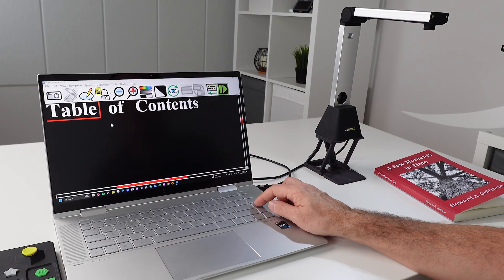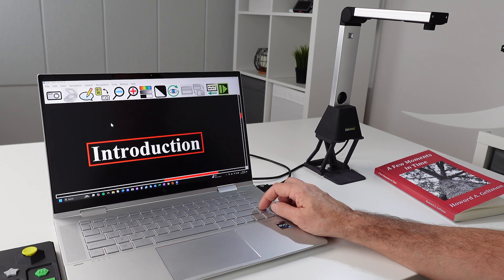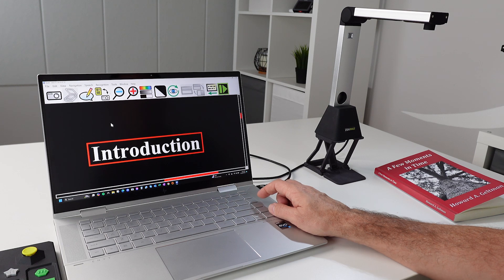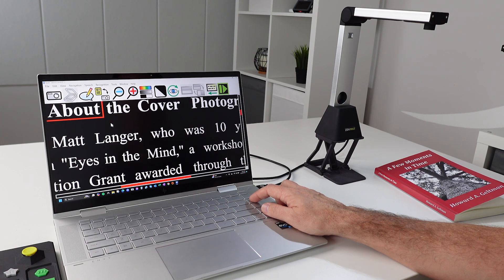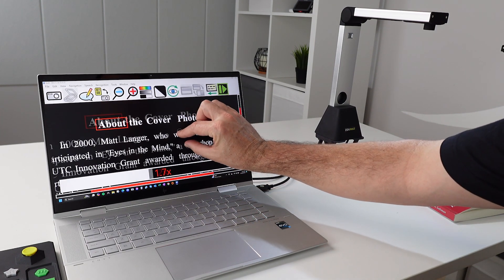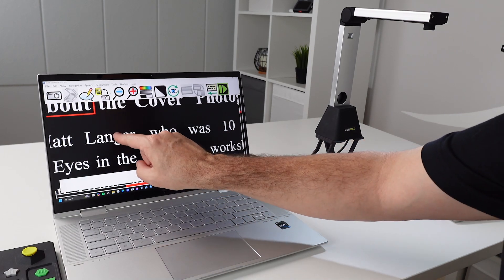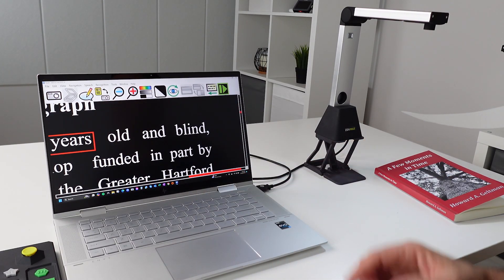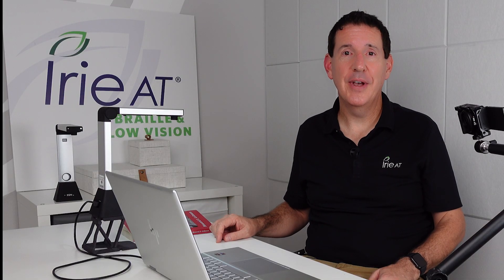Now when I want to read, it's all right there. I can flip through the pages — page 13, 14, 15, introduction. Flip back — page 14, 13, 12, 11. Anywhere I want to read, I just press and start reading. 'Langer, who was 10 years old and blind, participated in Eyes in the Mind.' It's a really cool way to scan everything in quickly with the multi-page scan and the Read It software.